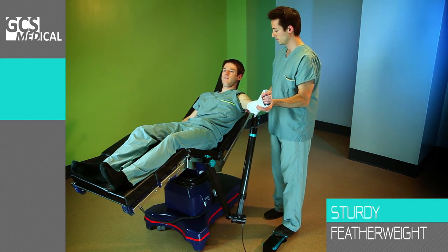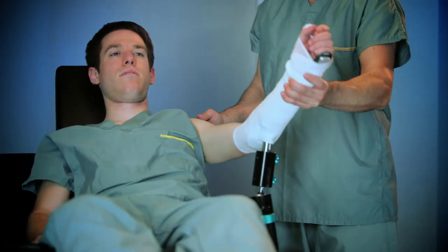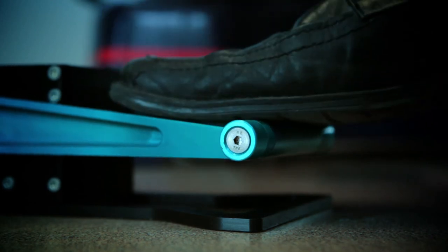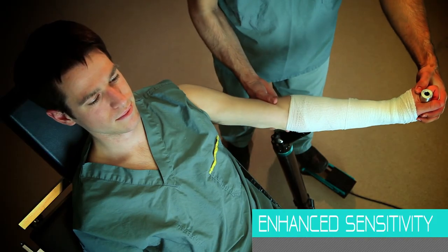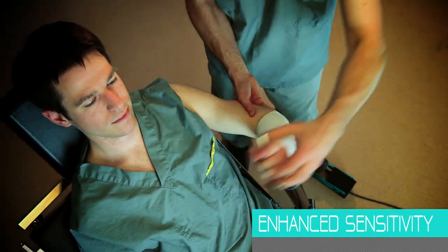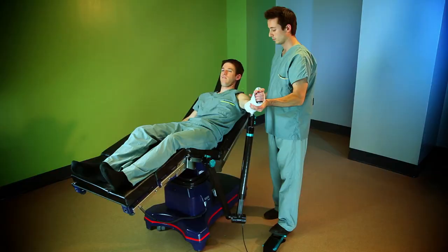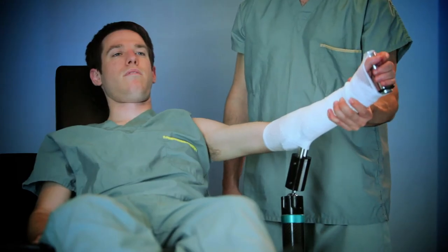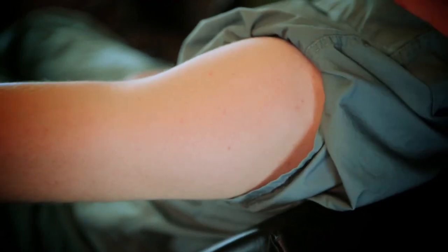The Assist Arm is a sturdy yet featherweight surgical assistant. The GCS Medical team developed the Assist Arm to enhance manipulative sensitivity, allowing the surgeon to make an accurate diagnosis and to gauge the appropriate force of traction required on the limb.